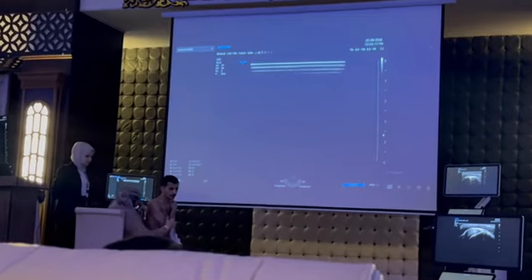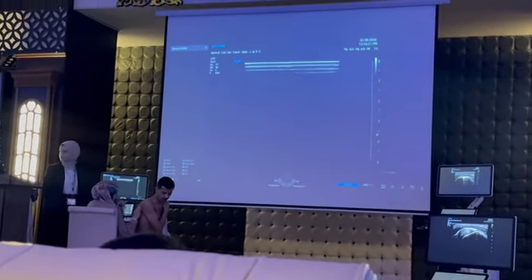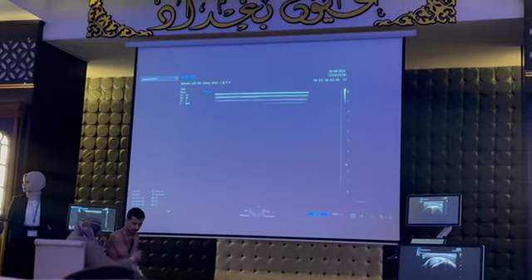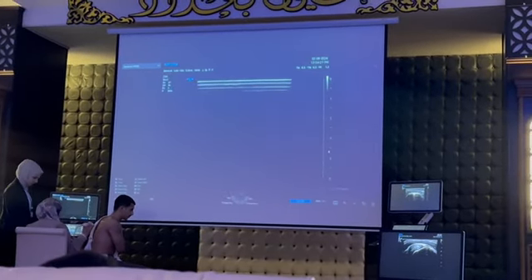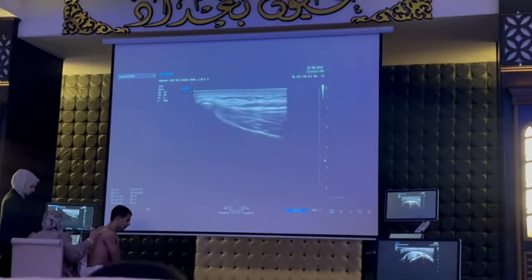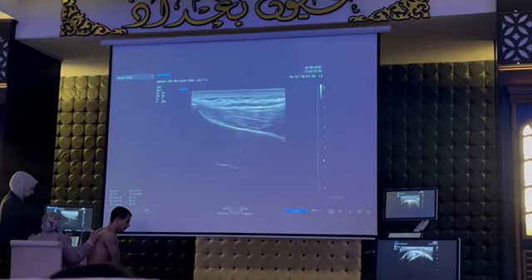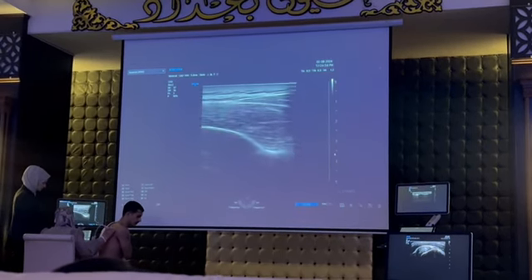This position is internal rotation. Its action is external. So I do internal rotation. So examination below the scapula: the spine of the scapula, it also has a fish-like appearance. You see? Continue lateral, lateral, lateral.